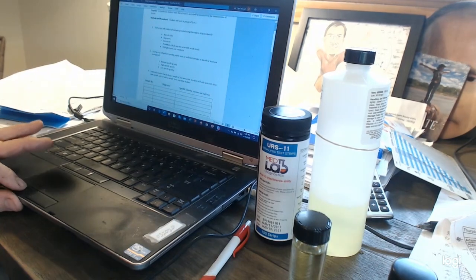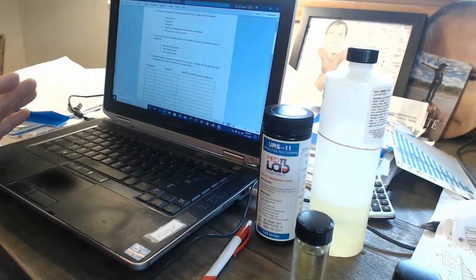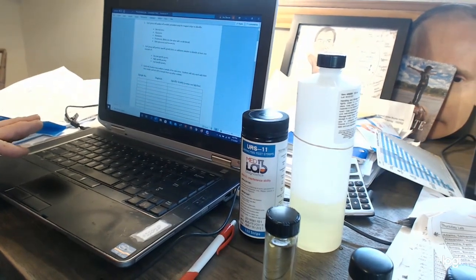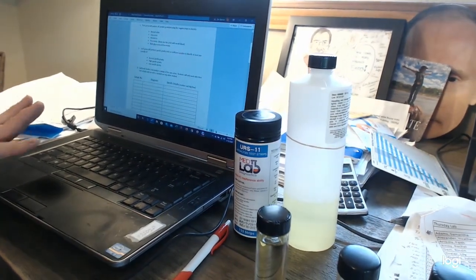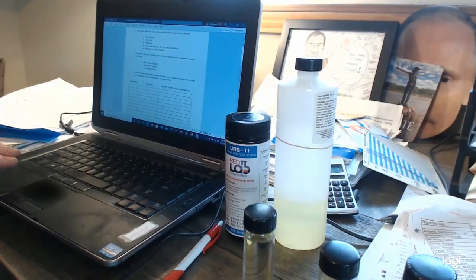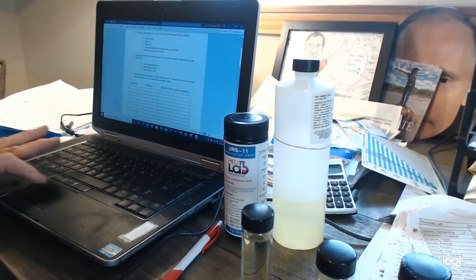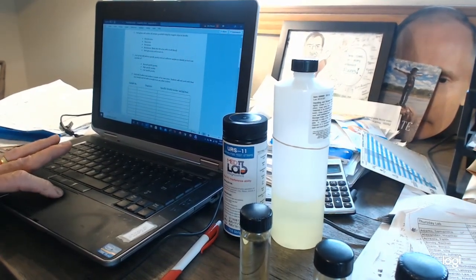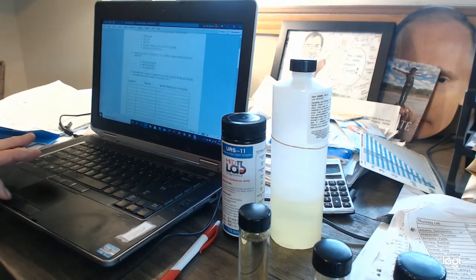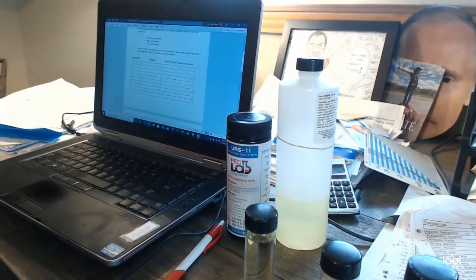We're going to measure normal urine. We're going to see if it has blood in it. We're going to see if it has glucose in it. We're going to talk about what it will mean if your urine has stuff in it that it's not supposed to. The samples I have down here, I'm only going to do 3 samples instead of doing as many as we would do in the lab. So just put sample 1, 2, and 3.